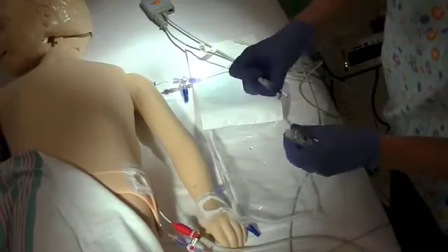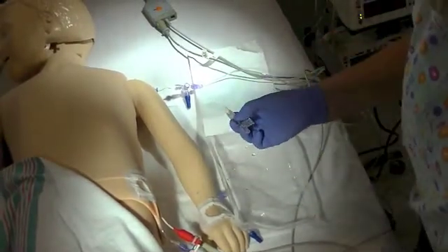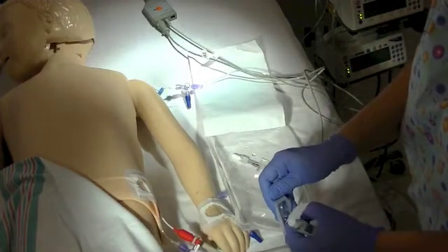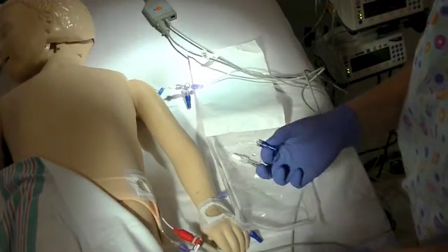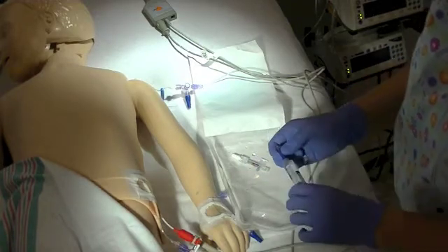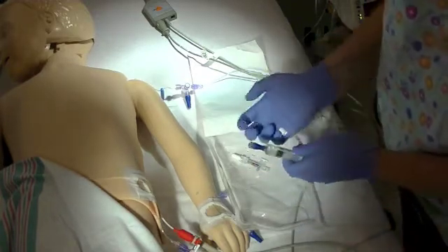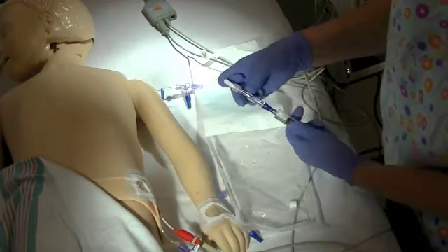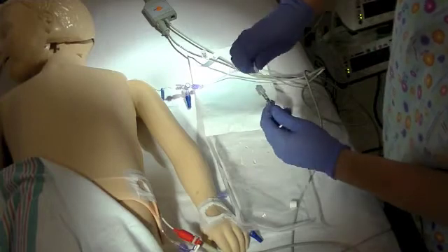Find the injectate temperature sensor housing from the PiCO arterial line transducer package. Prime a needleless access cap and connect it to the injectate temperature sensor housing. Finish priming this setup.